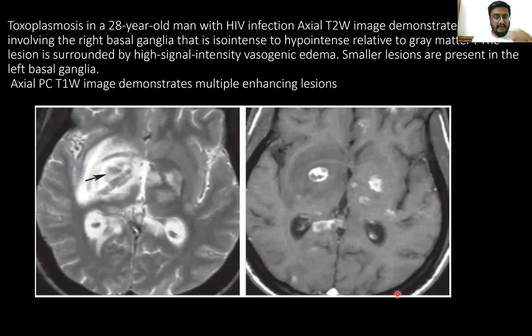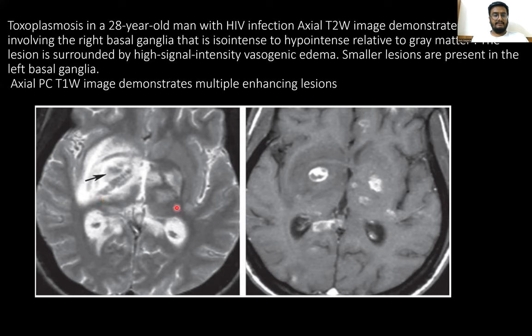In the second case, a 20-year-old patient with known HIV infection and toxoplasmosis. On axial T2-weighted images, there is involvement of the right basal ganglia, which is iso-intense to hyper-intense relative to grey matter. The lesion is surrounded by high signal intensity, representing vasogenic edema. Smaller lesions are also present in the left basal ganglia. On axial post-contrast, there are multiple enhancing lesions.